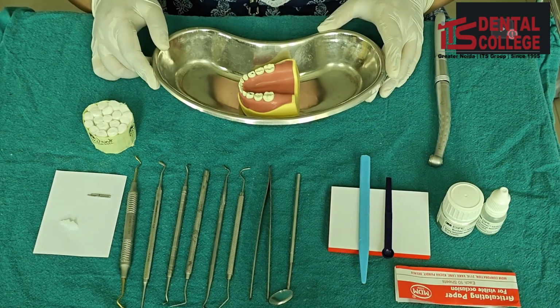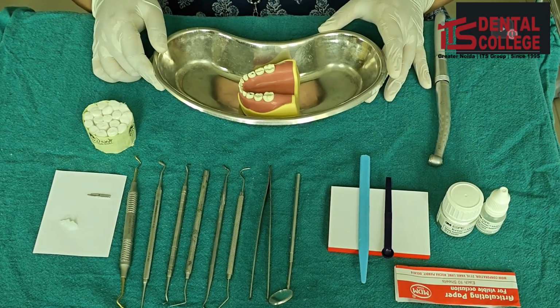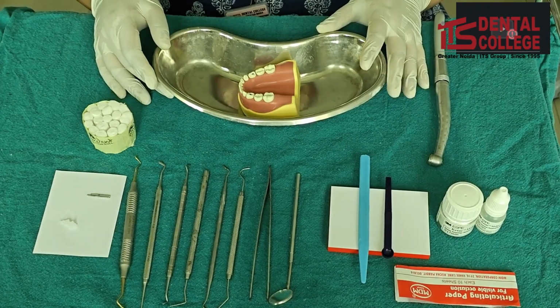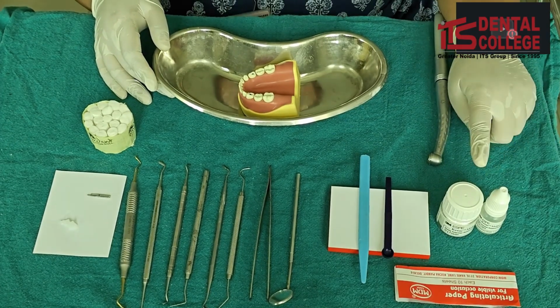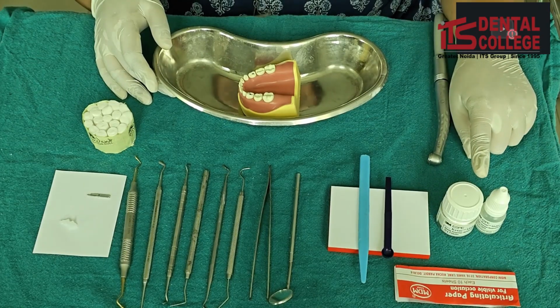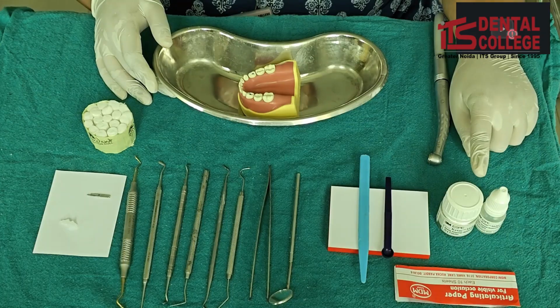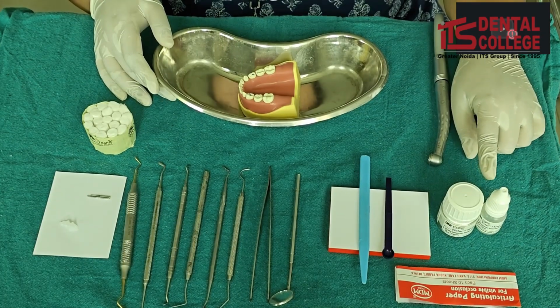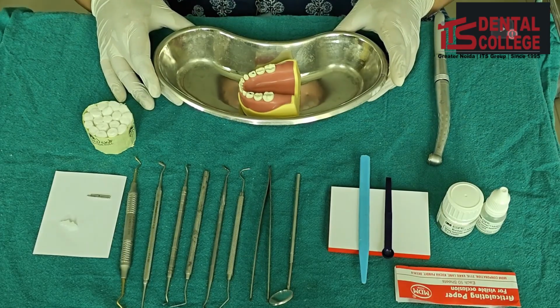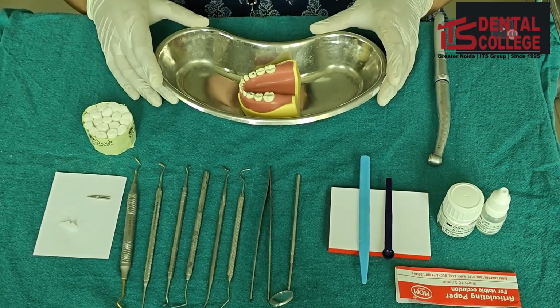Hello everyone. In this video demonstration, we will be discussing cavity preparation for a glass ionomer cement restoration, manipulation of glass ionomer cement, and finally filling the cavity with glass ionomer cement. Glass ionomer cement was first introduced by Wilson and Kent in 1972.